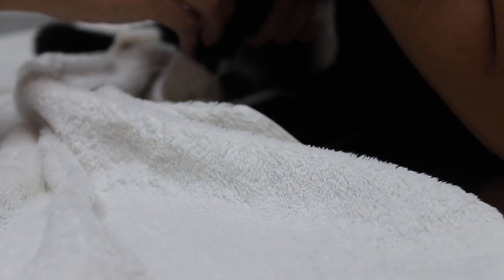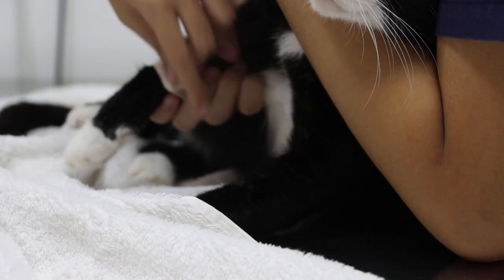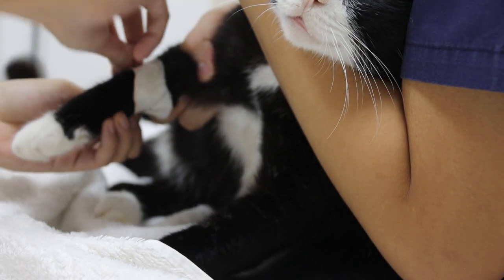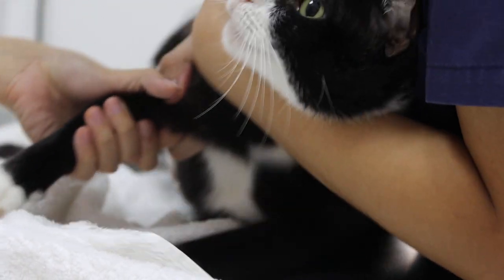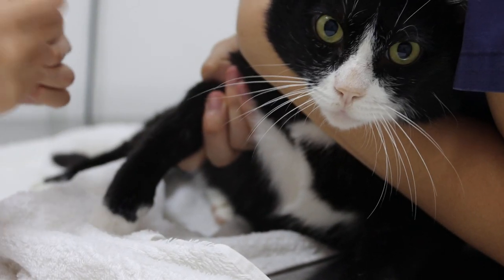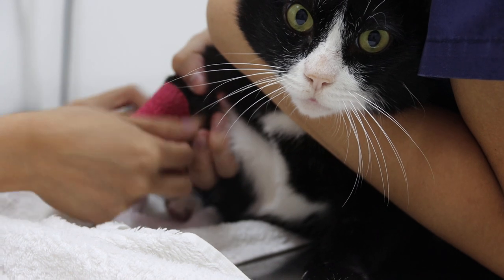Remove the cannula and then remove the tape as well. After that, we will bandage it to stop the bleeding. Put the gauze and then bandage it.